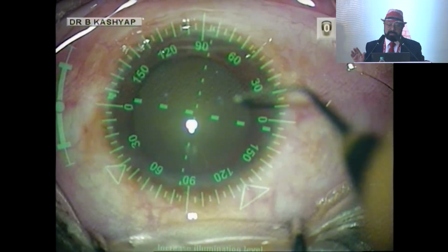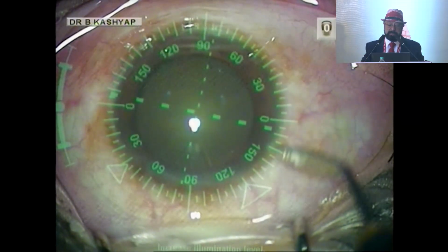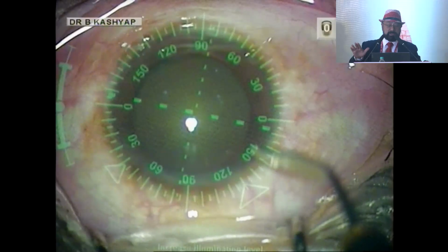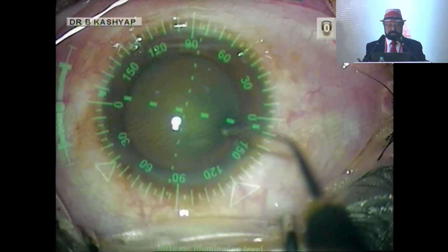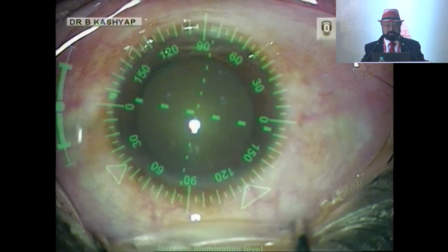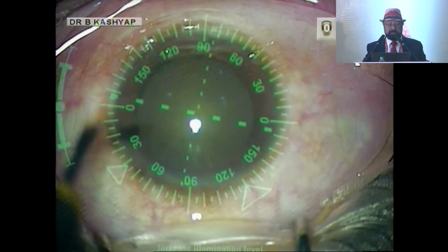So I am marking the arc from what place to what place. Planned and shown in the Verion. So this time we have to do the arcuate incision at 8 millimeter optical zone. So this 8 millimeter optical zone will be shown by the Verion.